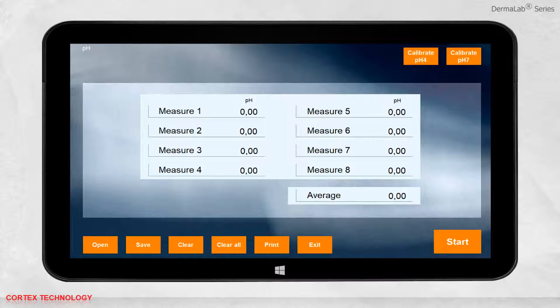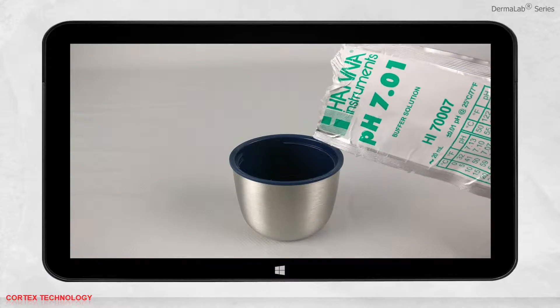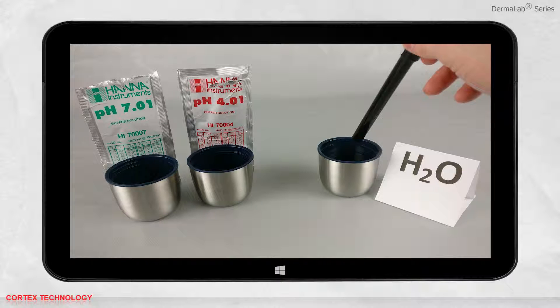Before you start a measurement, be sure that the probe has been calibrated recently. To calibrate the probe, you need pH 4 and pH 7 reference solution, which comes with the probe. You also need a glass of water to clean the probe between each calibration.